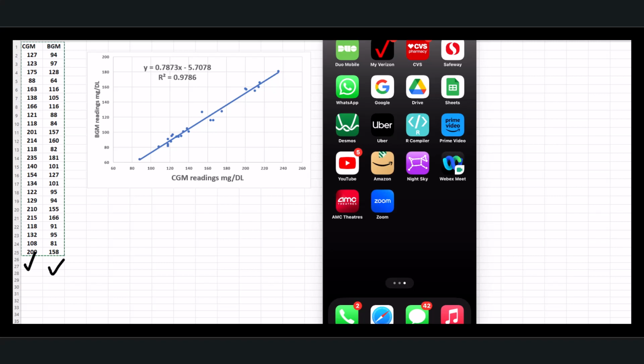And now I'm going to show you how one can do that in something easy to carry, like an iPhone. So for example, say it happens on the sidewalk, and I don't have my computer open, or in a dinner, I don't have my computer open there either. Or say, for example, I'm teaching a class, or I'm in a gathering or somewhere.